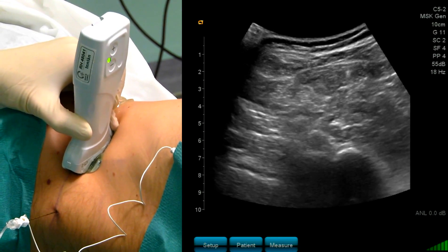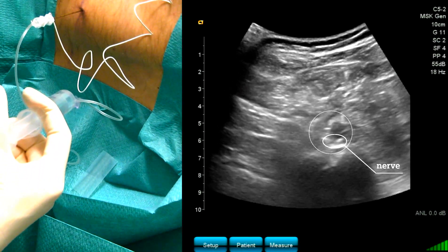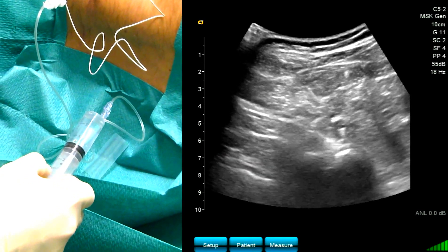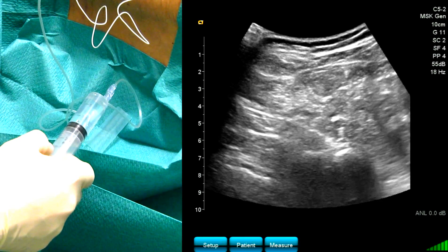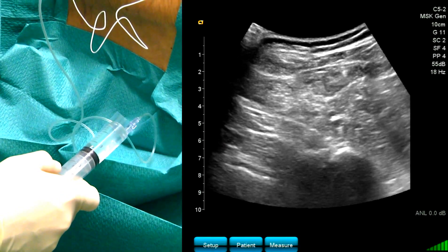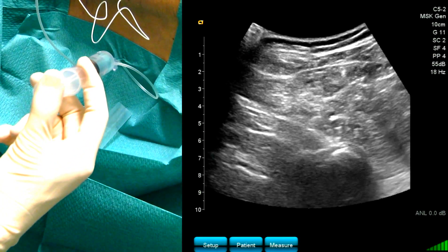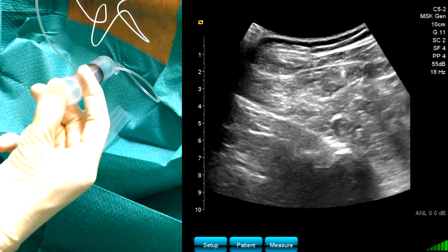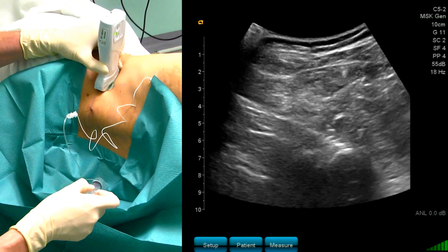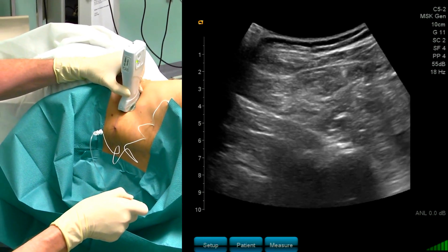Now I would like to inject my local anesthetics. You can see the local anesthetic spread. I perform frequent aspirations while injecting the local anesthetic.